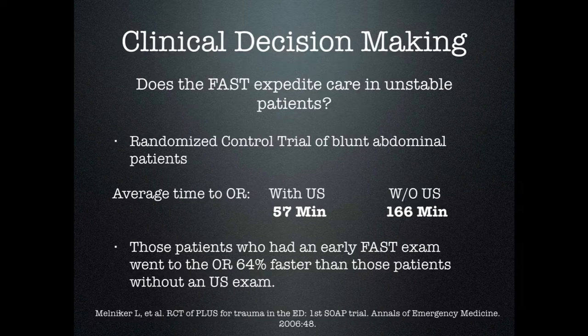So if there's so many limitations, why do we want to do this? Well, this is a very good trial done by Larry Melniker.